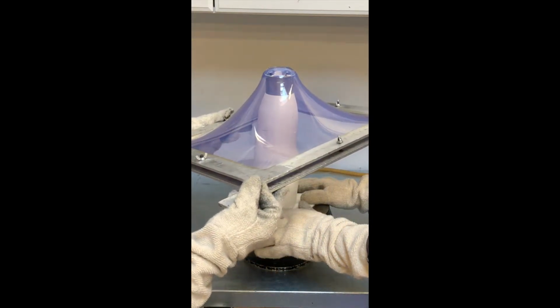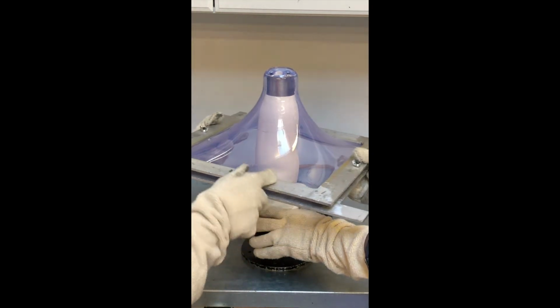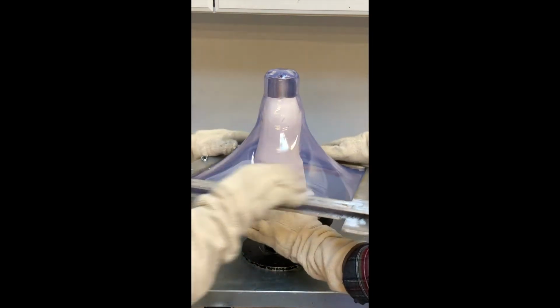Begin by working the plastic down over the model. Gently twist the plastic around the dummy and the positive model. This will help better mold the plastic around the sealing area of the dummy and increase the molecular strength of the plastic.